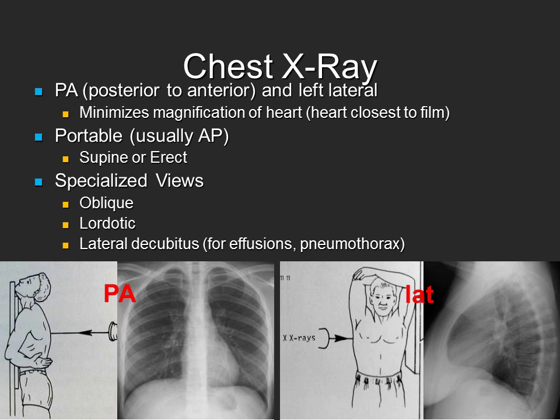The portable chest X-ray is an X-ray where the equipment is brought to the bedridden patient. This can occur in the ER, ICU, or the general ward. The portable chest X-ray radiographs are usually of less quality than stationary chest X-rays. They are usually shot in the anterior to posterior view.